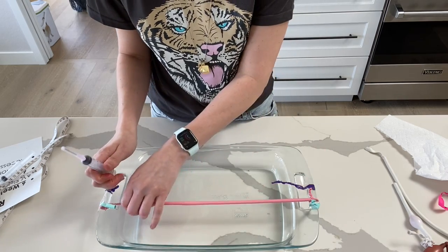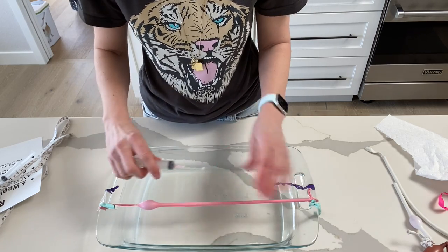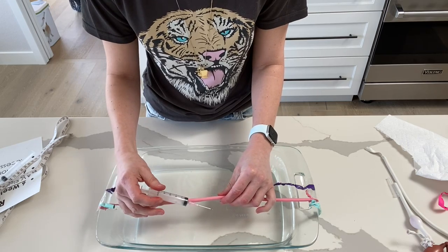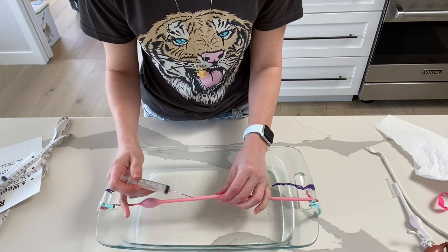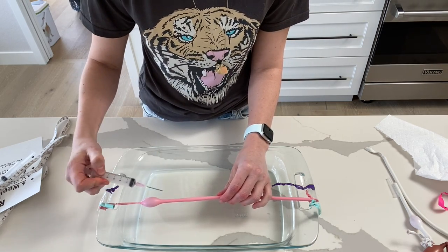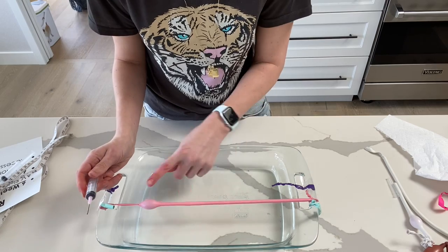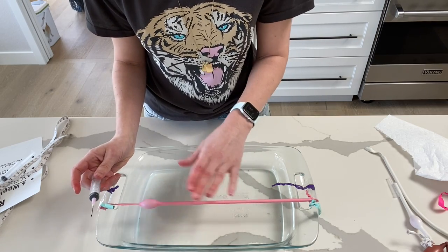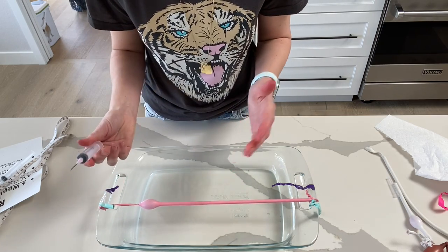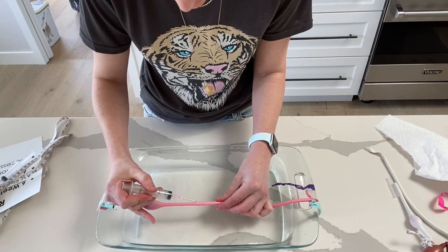I'm back. As we know, fistulas come in all shapes and sizes. One of the most common errors I see with people new to cannulating is advancing the needle too quickly. What they do is put the needle in fast, then look to see if they have blood return. If they don't, they pull the needle out and do it again. If you're going in and out of the fistula going through the bottom, on the surface everything might look fine — it might not look like you're causing any damage — but underneath you are causing a lot of damage and also a lot of pain.